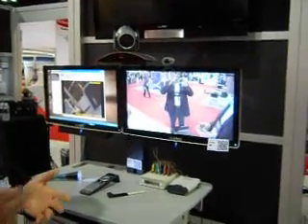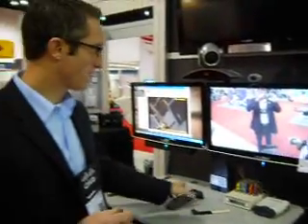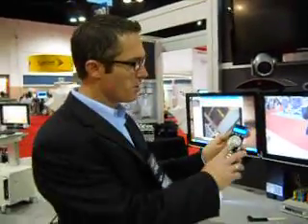So for a physical therapy aspect, you can see gait. You can track with the patient. I can actually use a remote to track the patient, use the far end. So a physician on the other side of the video call, whether they're in the next city, the next state, the next country, you can connect with folks, much like people do with Skype with their grandkids.